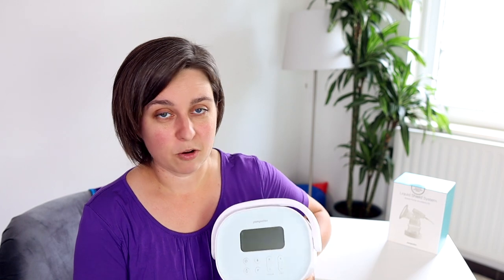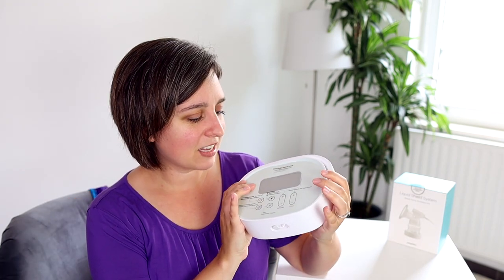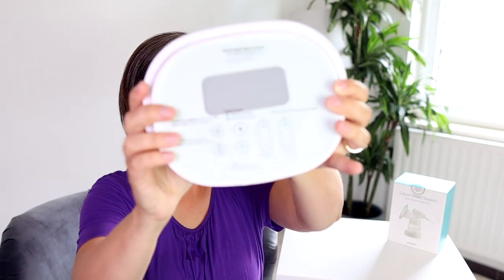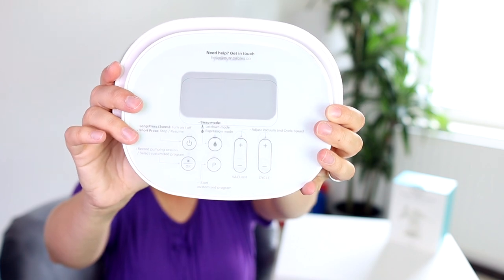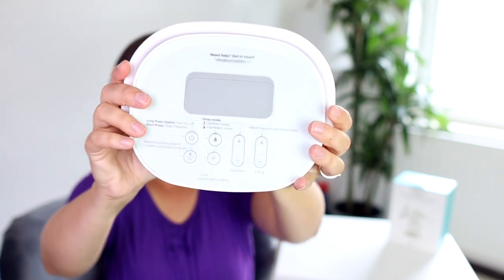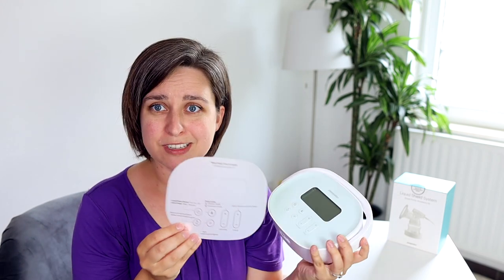The first thing I noticed when I opened this pump was how well it was packaged. It reminded me of opening a Mac device — it was sleek, everything was just like that. It came with this little overlay on top of the pump that gives you a quick guide to the pump. So if you've used a pump before, you can just use this overlay, it will tell you what all the buttons are, and you can just go. I thought that was really cool.